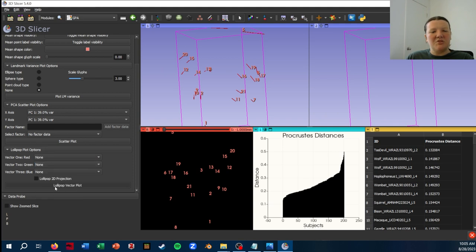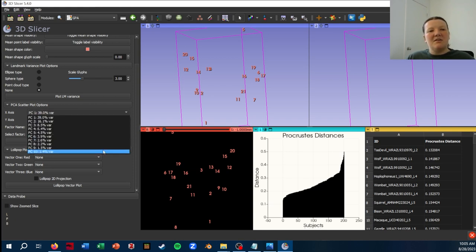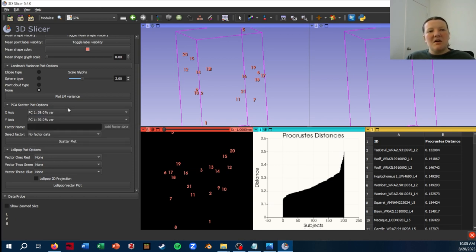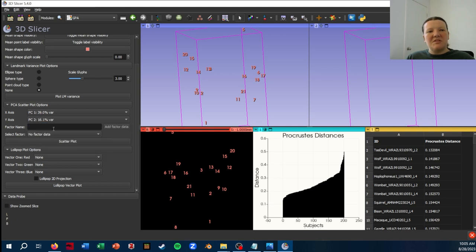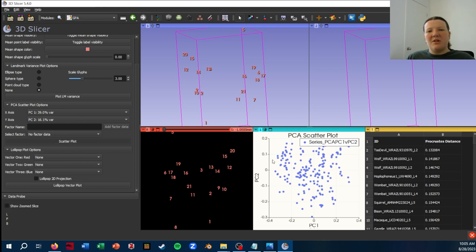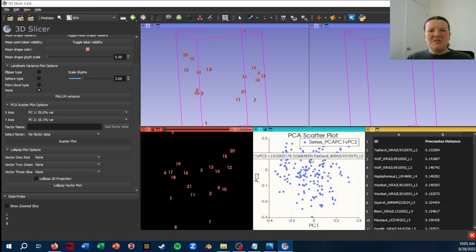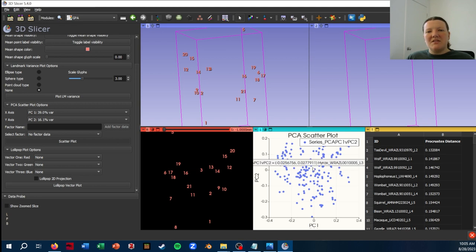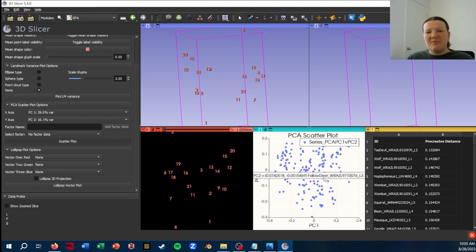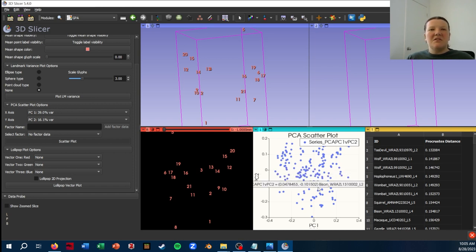Finally, if you want a preliminary look at your PC without having to put that data into R, you do have the option to do a scatter plot. So I'm just going to select PC1 and PC2, and then click Scatter Plot. And you'll see here, you have an option for splitting these by a different factor or group. I find that easier to do in R or Mathematica. So this is just for a preliminary look. But you can hover over each point and see where it falls. And that'll give you at least a decent idea of what shapes are closer to the mean and what are further out.